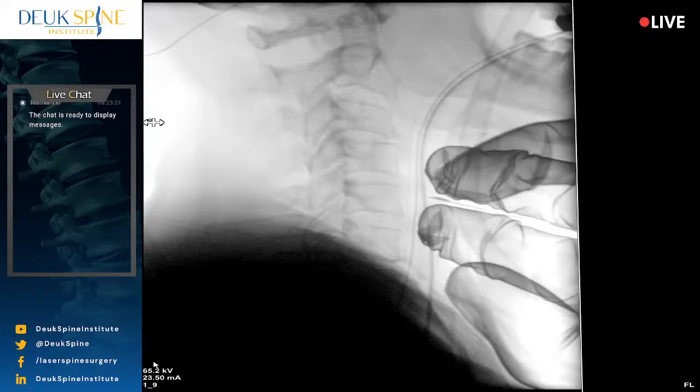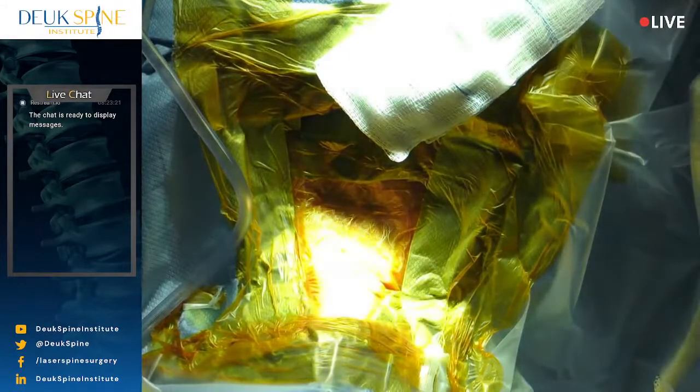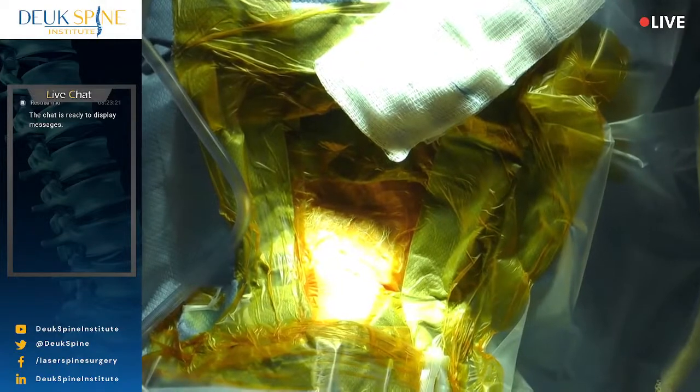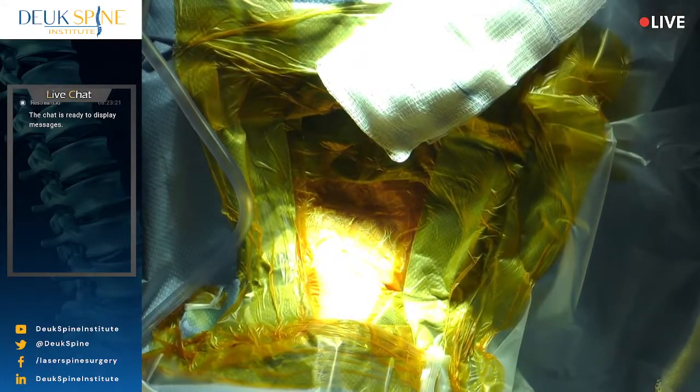So we're pretty low. We need to get up higher. So I will need you to hold his neck in slight extension as I manipulate him. I hate C3-4. C3-4 and C6-7 are the worst. But unfortunately, take your time. Yeah, go ahead and deal with that first. What I like is when you grab the head, you push, extend a little bit, and push his skull towards his feet so that he does this rather than pulling. It's kind of counterintuitive, but does that make sense?